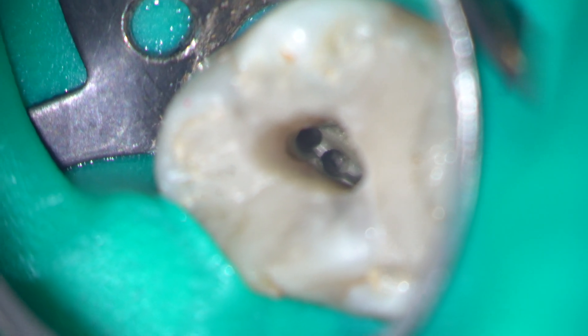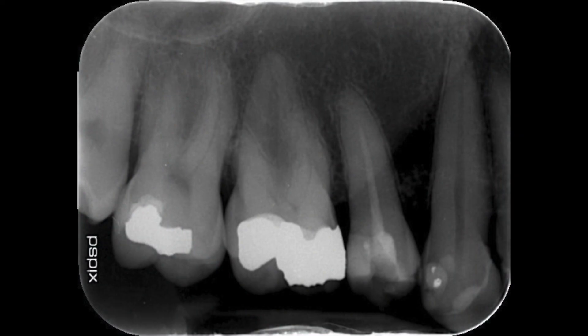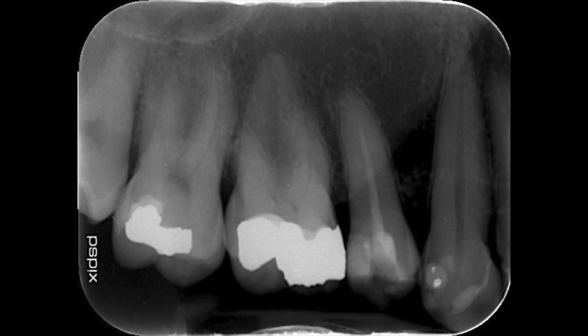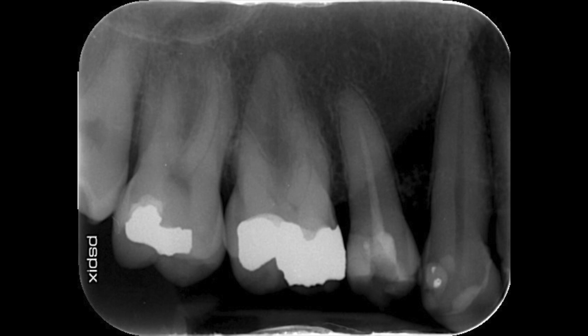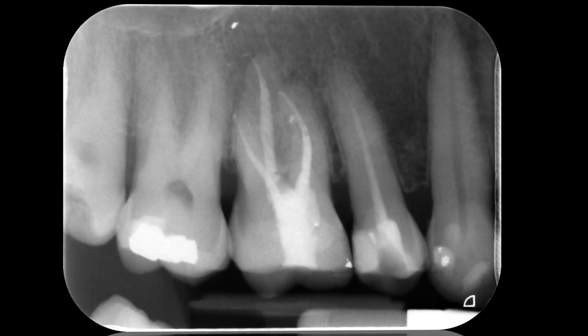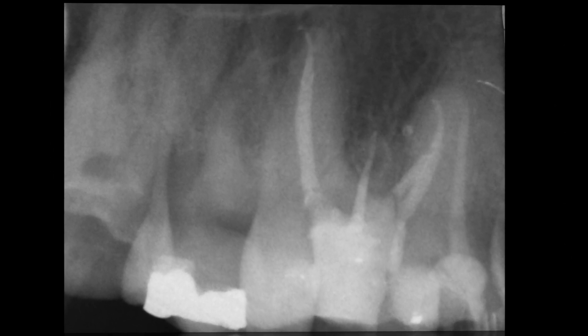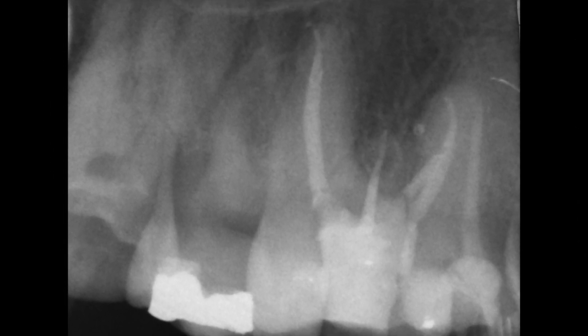The canals were all dried with sterile paper points before being obturated using a vertically compacted gutta-percha technique. Here again you can see the preoperative radiograph of the maxillary right first molar. And here's my final radiograph showing good coronal apical seal with some lateral anatomy at the apex, and the distal view showing the confluence of the MB1 and MB2.